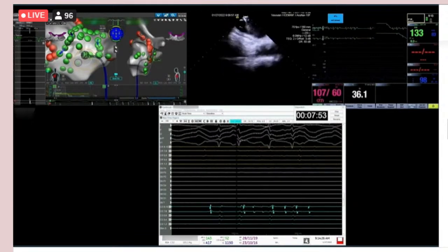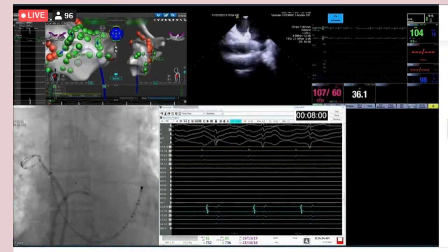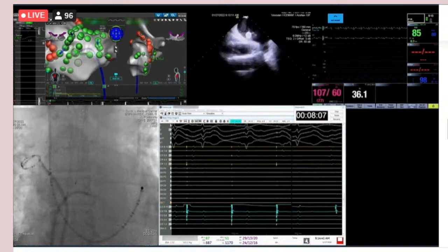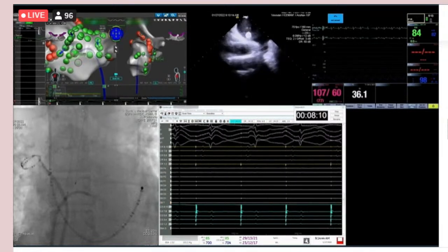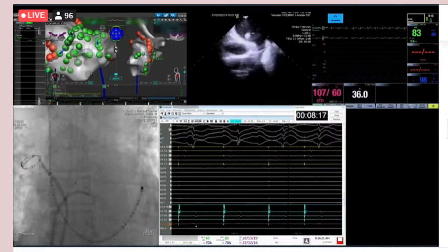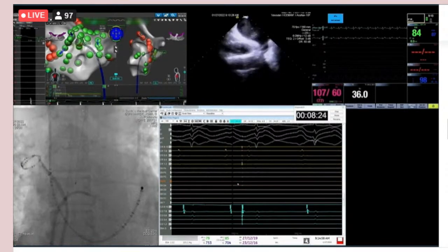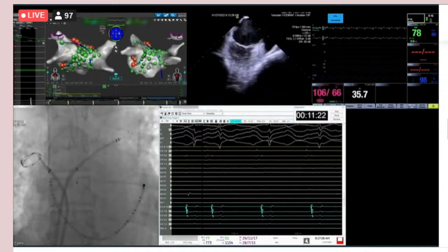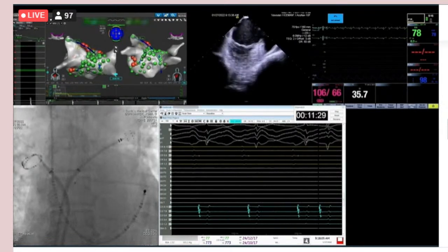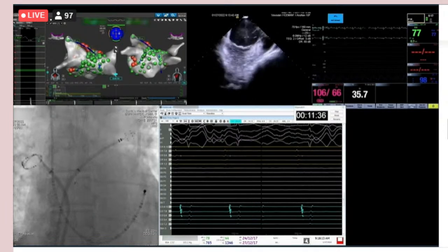But you see the distal coronary sinus, how it changed? I don't know if you want to back up here, but I only used IRE and not RF along the lateral following the coronary sinus catheter. And you see that was effectively isolated at the previous location. And then ablation along the posterior wall actually terminated this into sinus rhythm in this person who'd been in AFib for 6 months despite cardioversion, et cetera. And there you see pacing off that, again, the distal coronary sinus is isolated just with electroporation in those locations. And end of the case, just did the typical testing for the phrenic and isoprel, and that was it. And this patient's actually already followed up and is doing fantastic.